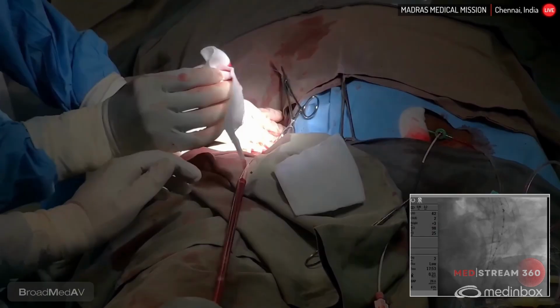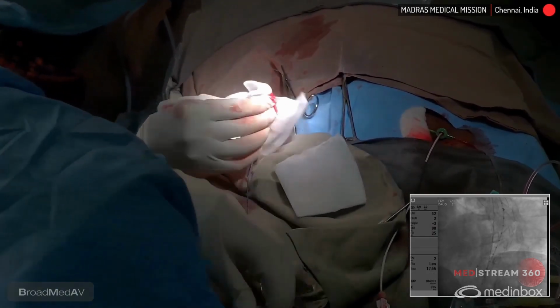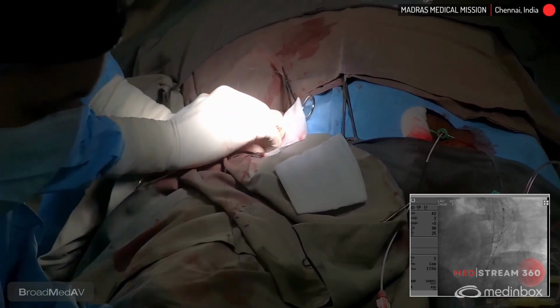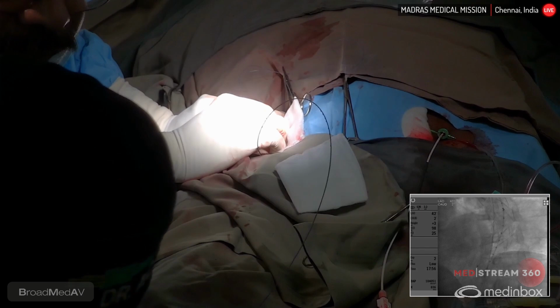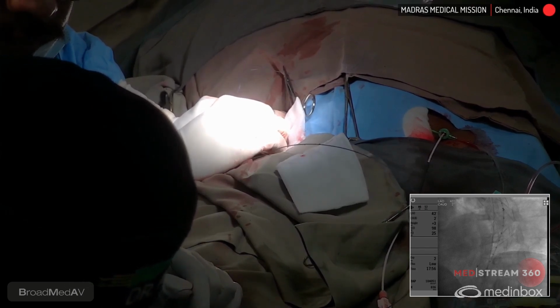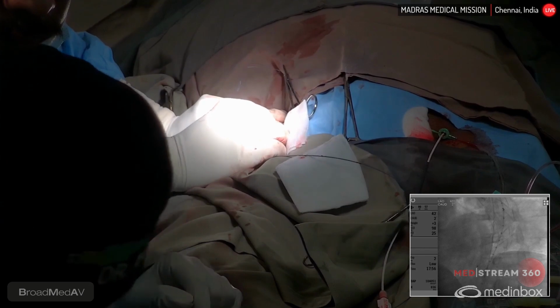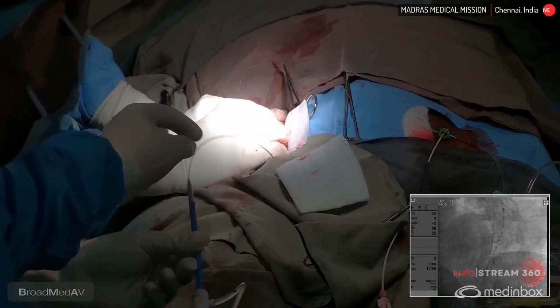Okay, now this is the important point where the groin has to be compressed well. There's a 24 French rent in the common femoral. The common femoral artery size here is almost 9.5 to 10 millimeter. Hence, I think we can leisurely put 3 ProGlides.